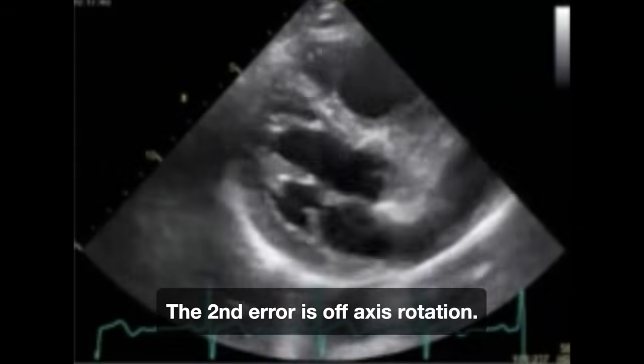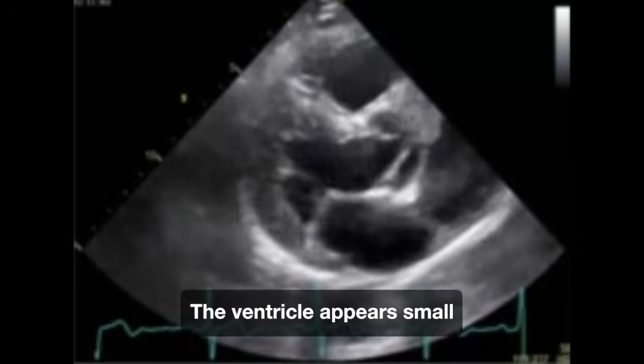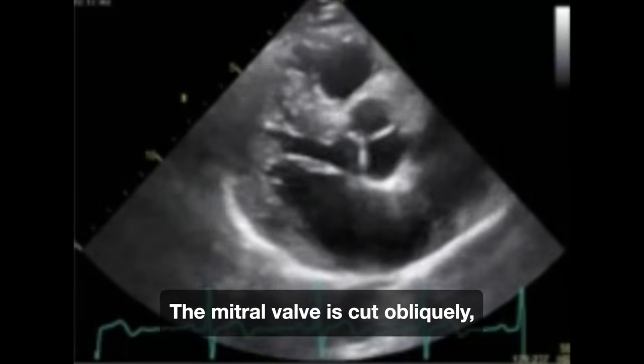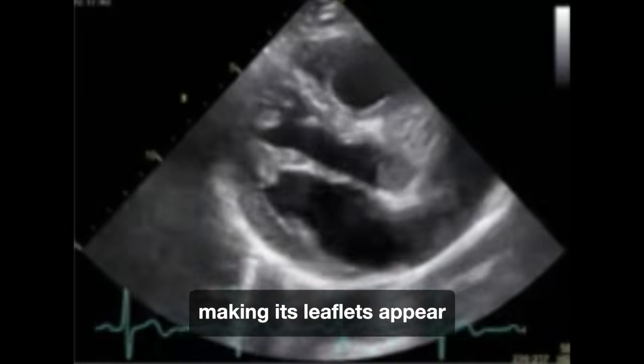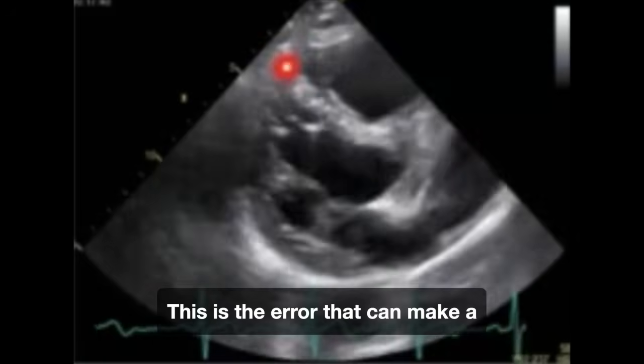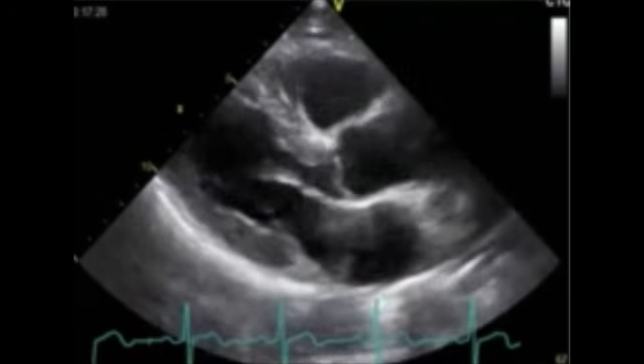The second error is off-axis rotation. The ventricle appears small and underfilled. The mitral valve is cut obliquely, making its leaflets appear abnormally thick. This is the error that can make a normal heart appear abnormal.